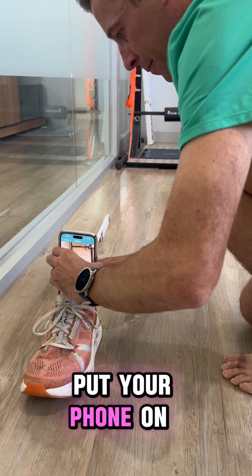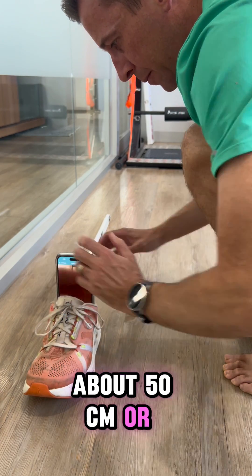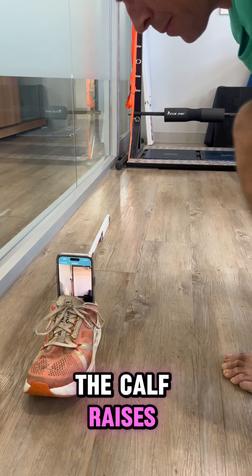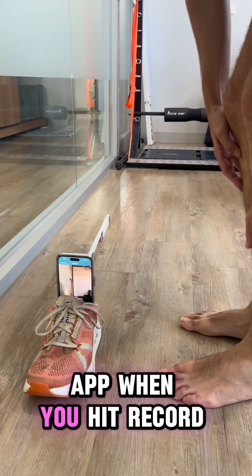Now it's time to set the camera up. Put your phone on the floor — placing it in a shoe is a good idea — about 50cm or 20 inches from where you will do the calf raises. Ensure that you turn the phone off silent so that you can hear the beeping noise of the app when you hit record.